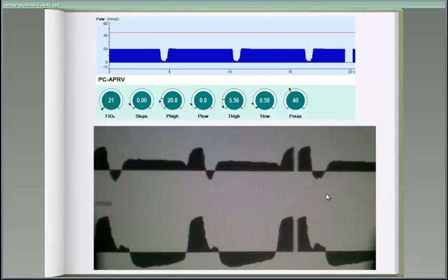In fact, this is a patient on ARDSNet, and if you look carefully at ARDSNet patients, I think you might see a few things. One of the things that you'll see is they can actually pull the airway pressure down. In fact, here's the PEEP level, and the patient begins their inflation with a pleural pressure deflection, actually dropping the PEEP level, and the patient actually continues to suck during the inspiratory phase and continues during the back end. Now, that patient is developing a tremendous amount of negative pressure or transpulmonary pressure, and probably because their lung volume is less than optimal. Not tidal volume, but lung volume.